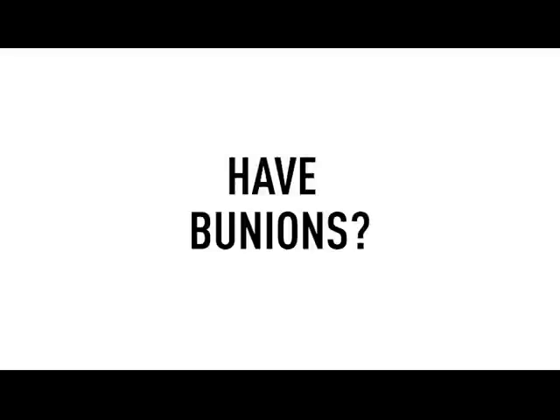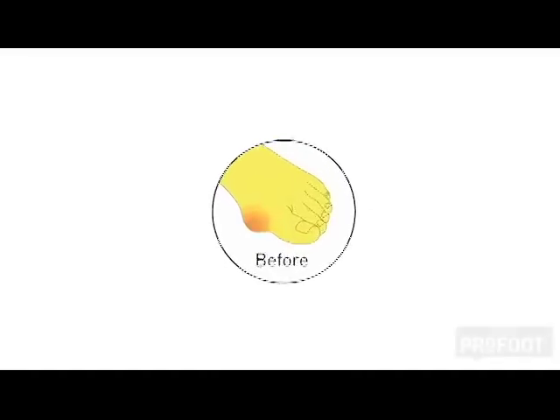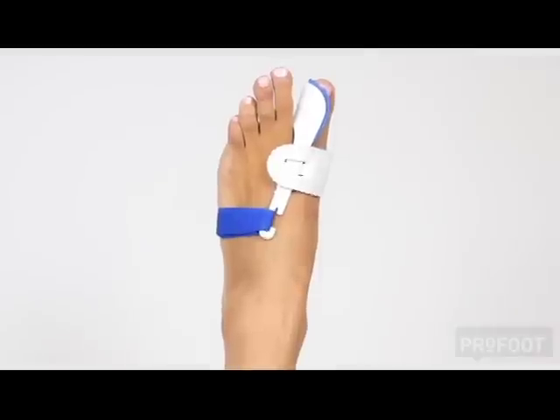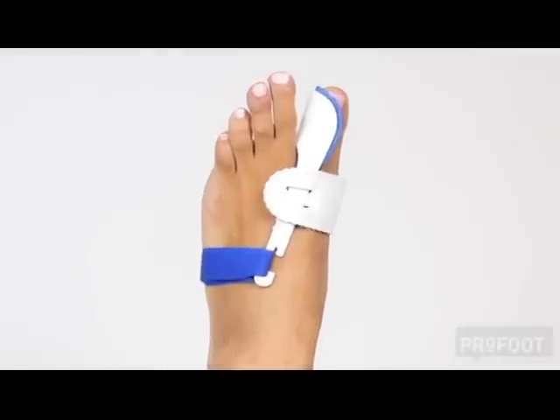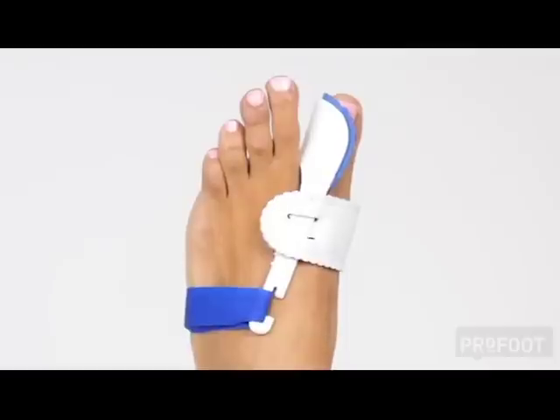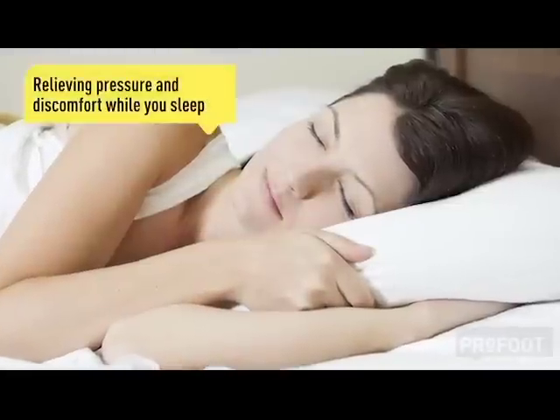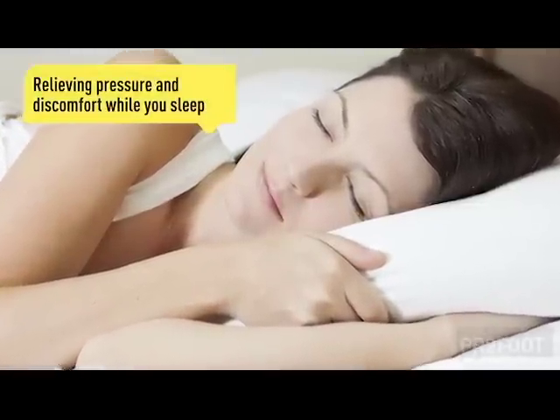Have bunions? Say goodnight to painful bunions with ProFoot's podiatrist recommended bunion regulator. This professional bunion regulator gently realigns the tight tendons and muscles of the big toe, relieving pressure and discomfort while you sleep.